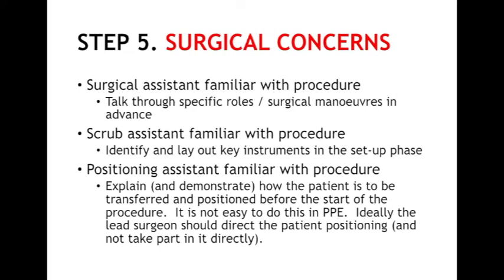Step 5 addresses surgical concerns. The surgical team should discuss their familiarity with the procedure, particularly the assistant, to ensure that maximum help can be given at the critical time points. Scrub assistants may be unfamiliar with certain instruments, and these are best laid out in advance. Sutures preloaded and syringes filled.